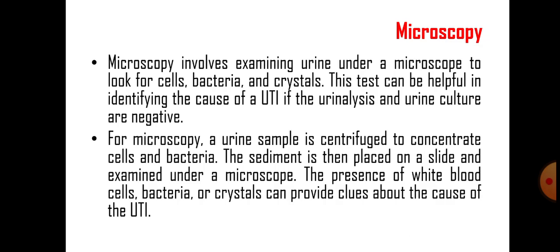Microscopic study is a very fundamental and essential one, and it enables us to visualize bacteria and crystals in the urine. This test can also be helpful in identifying the cause of UTI. Microscopy is a very essential technique. Sometimes the urine sample may be subjected to centrifugation, and the concentrate may be examined under the microscope for the presence of cells and bacteria.